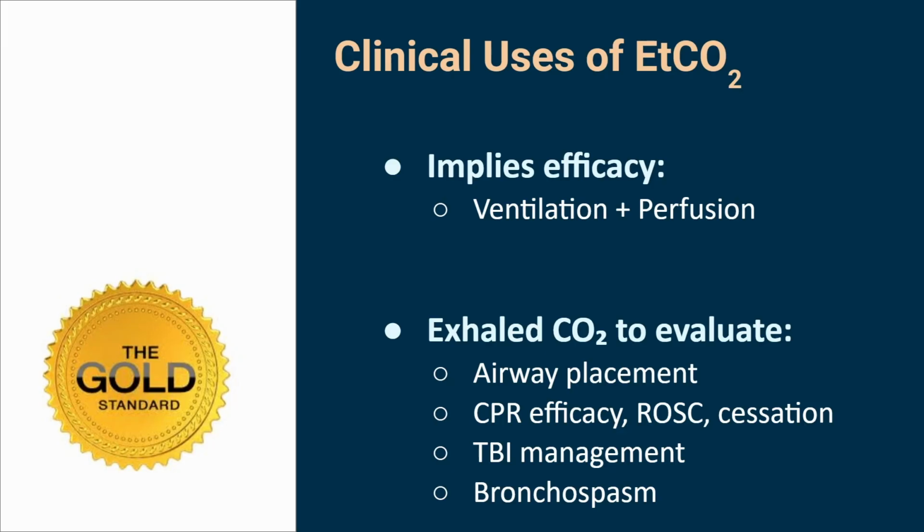Now, end tidal is awesome, but I guarantee you're going to hear out there, well, end tidal is perfusion. It implies it. What's most important to know first is that it's not just perfusion, it's also ventilation. Meaning, end tidal is measuring what? Millimeters of mercury. That's how it's measured, but what is it measuring? It's measuring carbon dioxide.